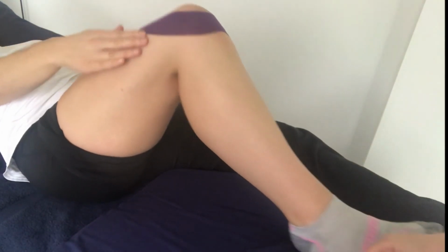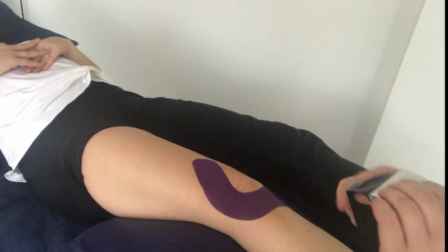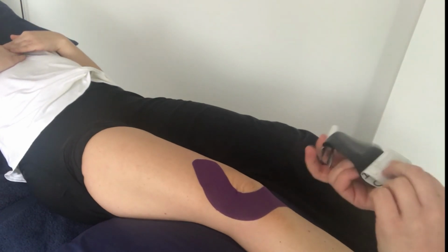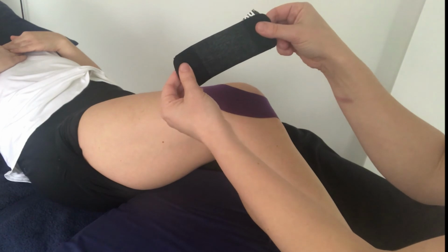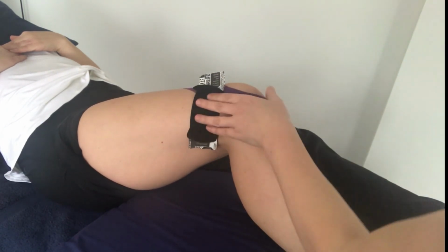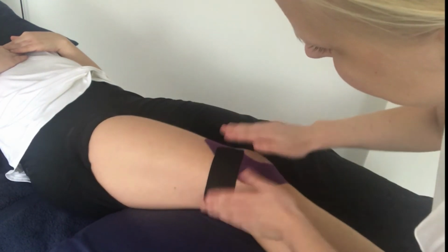For desensitization, the client will let you know where they have been experiencing pain. A smaller amount of tape, break off the paper at the back, and with a light tension of the tape onto a bent knee, apply the tape over the area of pain. Rub the tape down, straighten the leg, stick both anchors down, and rub the rest of the tape to stick the tape down.